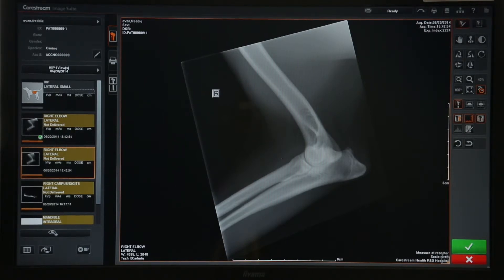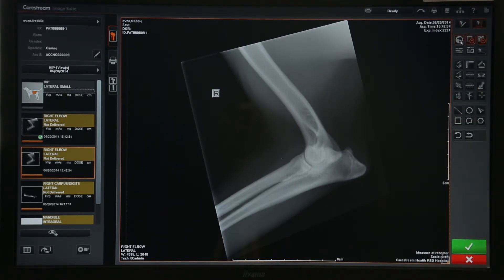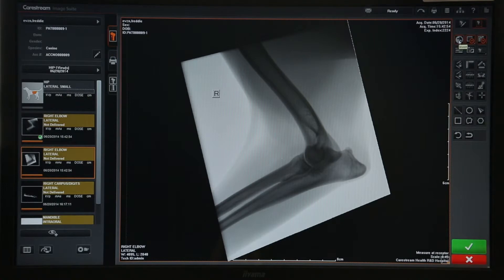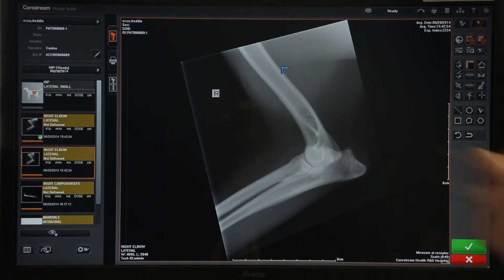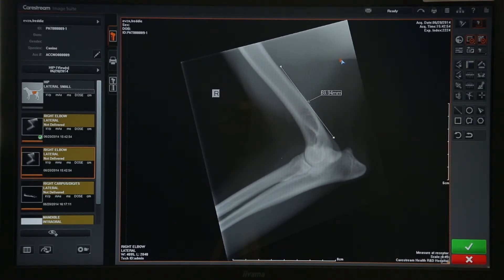You also have advanced tools on the system under the second tab. In advanced tools you gain functions like inversion, where black goes to white and white goes to black, and this is also where all your measurement tools are. The ruler is the most simple one — from the point of the arrow you first click, move the mouse to where you need to measure to and click again, and it will give you a measurement. If you don't want that measurement you can drop it in the bin.